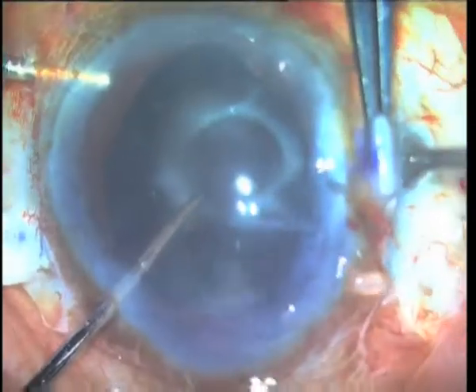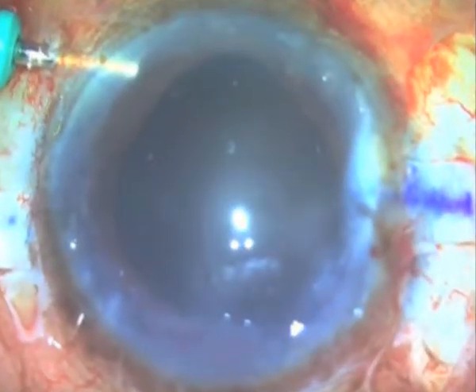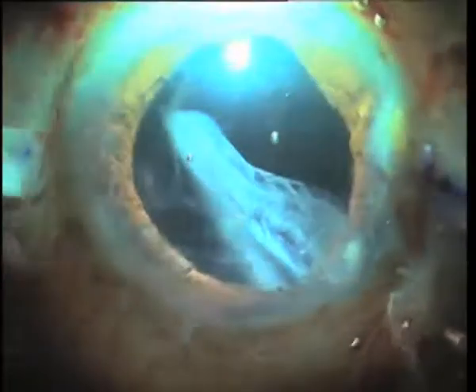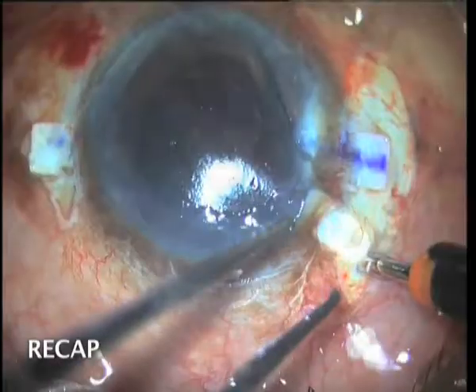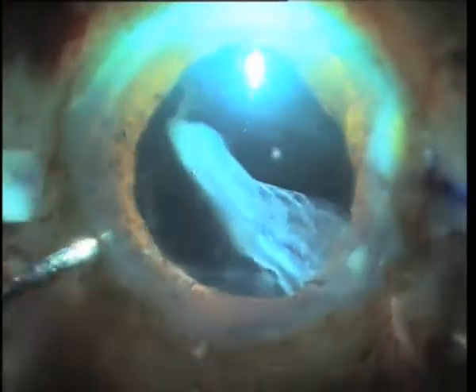On attempting to externalise the haptic of the IOL, the grasp on the haptic is lost and it tumbles posteriorly into the vitreous. While a pars plana entry is made in preparation for retrieval, a sudden egress of fluid from the side port causes an upthrust from the posterior segment, which aids in bringing the IOL capsular complex anteriorly.